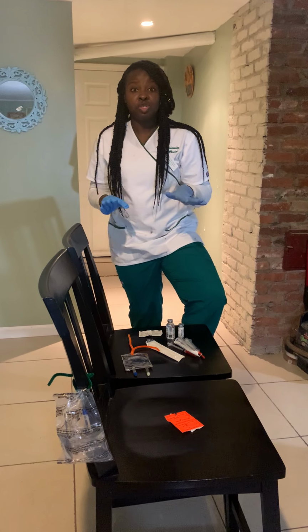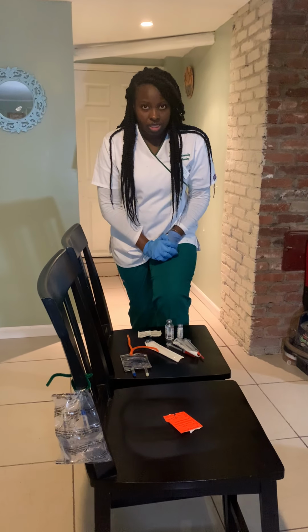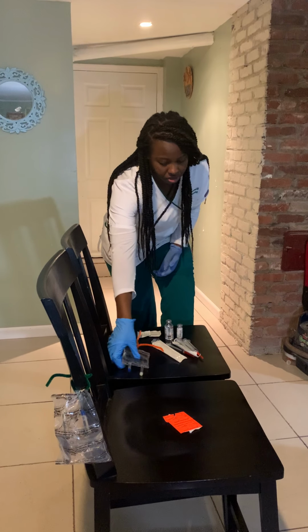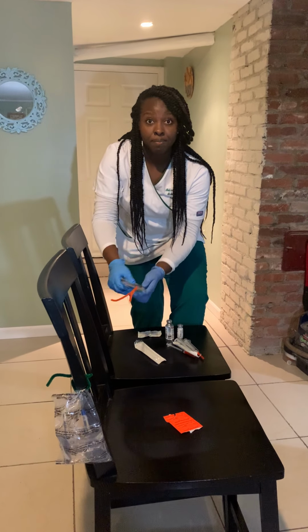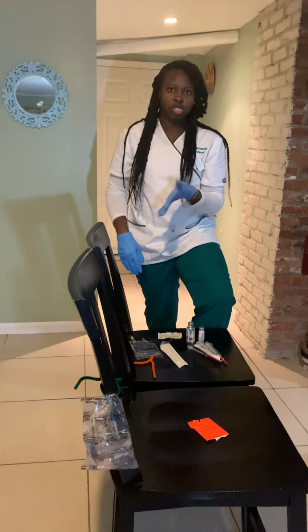Then I'll use my other syringe to withdraw 1 ml of the medication and insert that into this pouch, which will now become my piggyback, which I will bring to my patient room to administer.